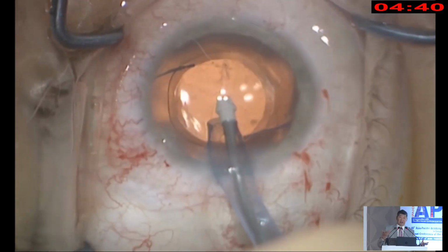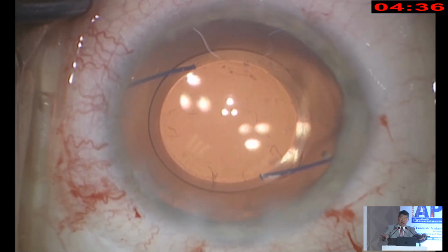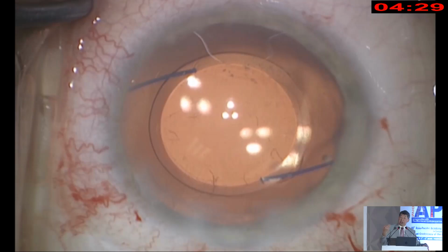So I have to vacuum out a little bit of it before I then plop the optic through there for the optic capture. Otherwise, what happens is that trapped OVD will sort of push the optic forward, and you'll get a myopic surprise. And the way you get out of that is I'd have to YAG the posterior capsule, and that would then let the OVD bleed out posteriorly.